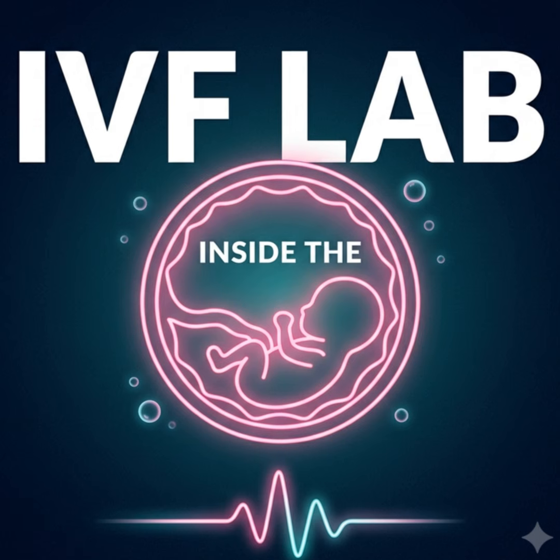Okay, pillar 1. First, it analyzes microscopic image features. Utilizing convolutional neural networks, the AI scans the texture of the cytoplasm. It measures the exact density of the cells. It calculates the precise thickness of the zona pellucida, which is the protective outer protein shell of the embryo, pixel by microscopic pixel. It's quantifying things we literally cannot see with our organic eyes. Correct.